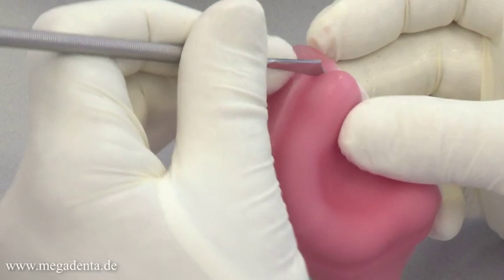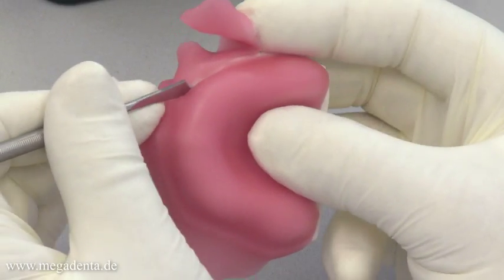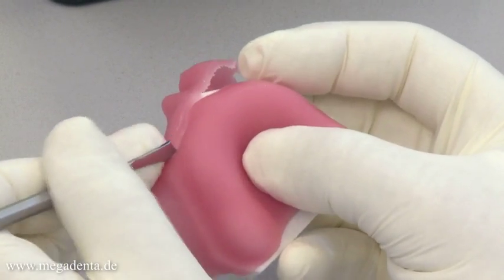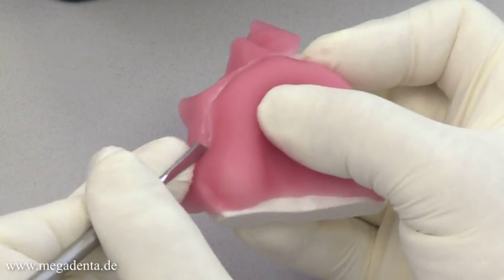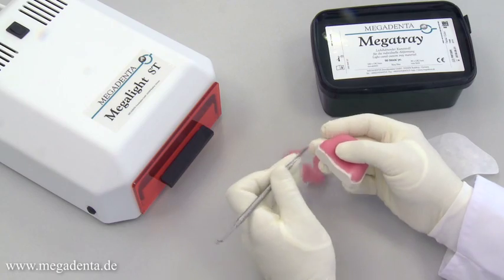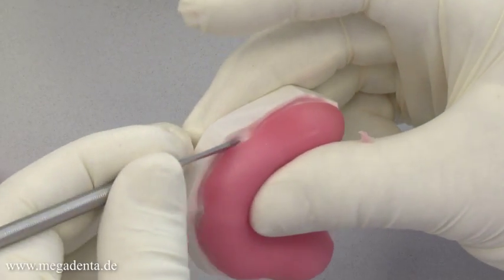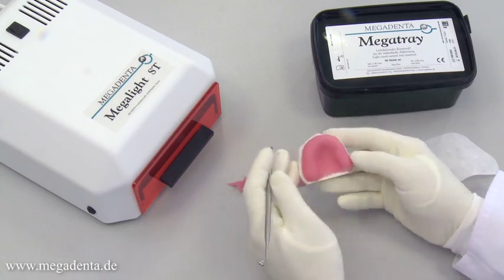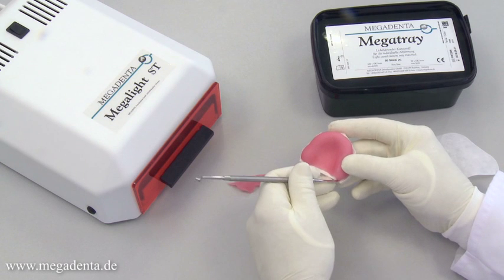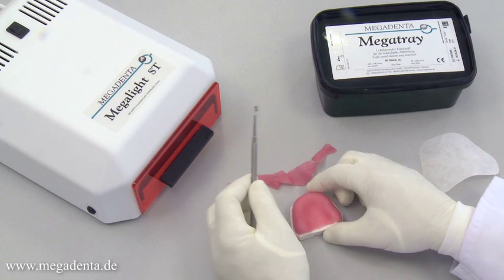Cutting with the instrument can be done according to the prepared and marked lines on the plaster model. Megatray wafers are slightly transparent to allow visibility of the markings on the plaster model, ensuring a safe cutting process. The covered shape of the instrument allows the exact cut out of the final lines of the tray.